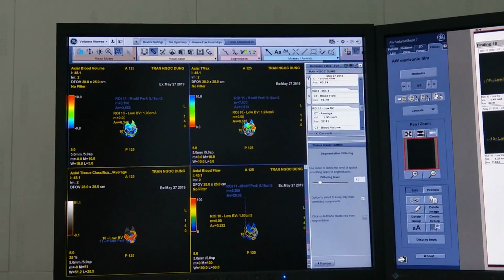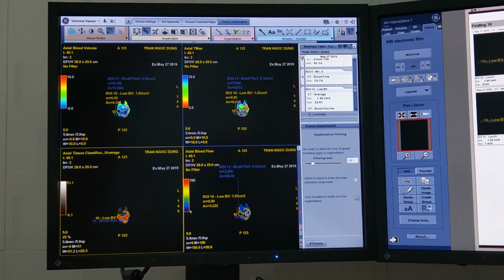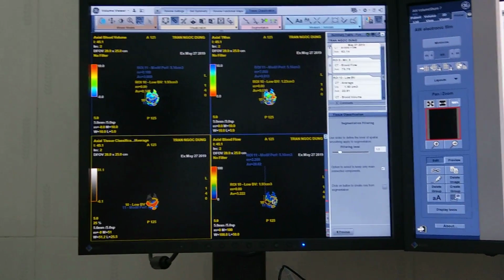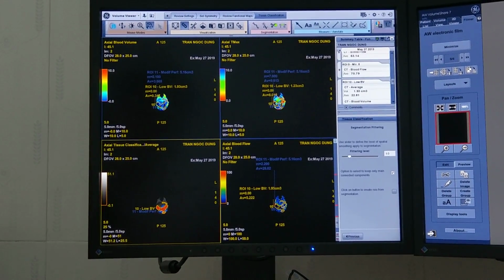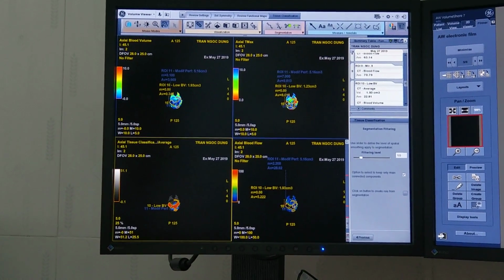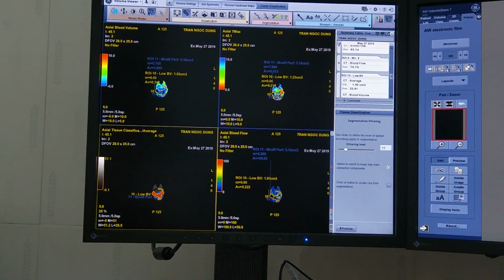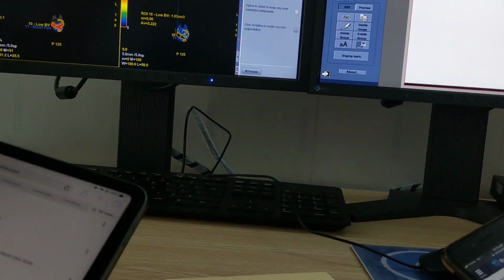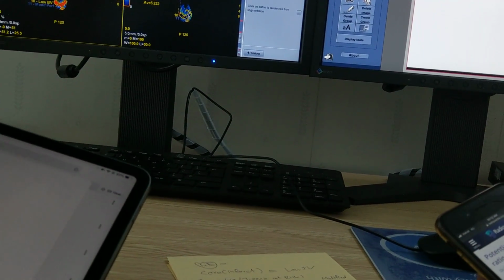If you want, like this, you can also use PRR, the one that I calculated. Potential recuperation rate, this one. If you use Siemens software, they use this. They calculate, right? Automatic calculation. This one, potential recuperation ratio.